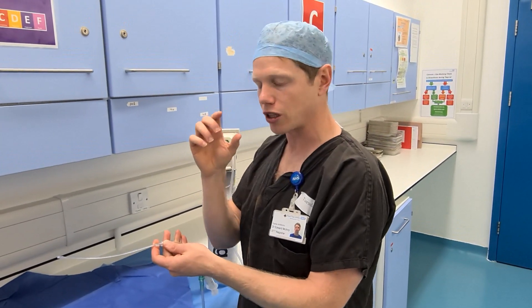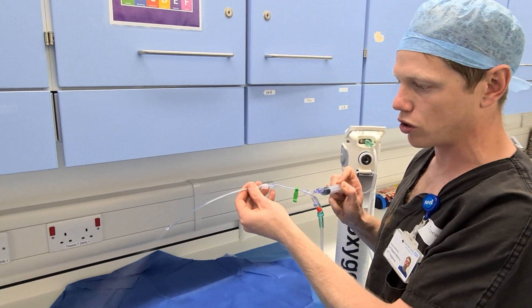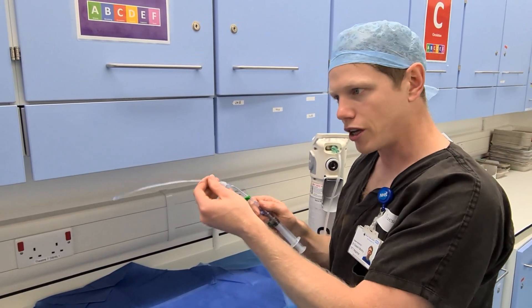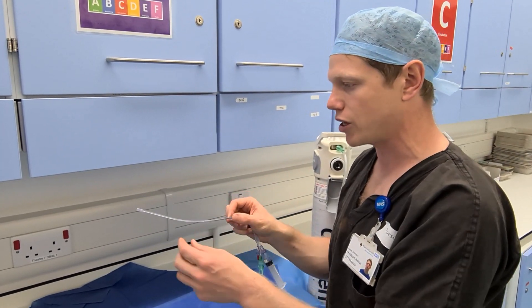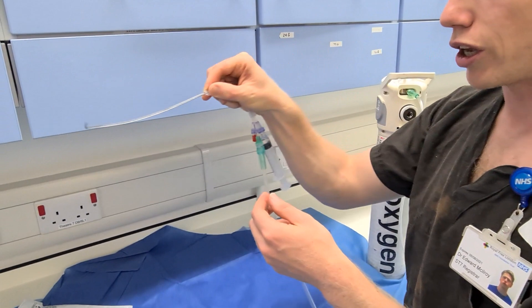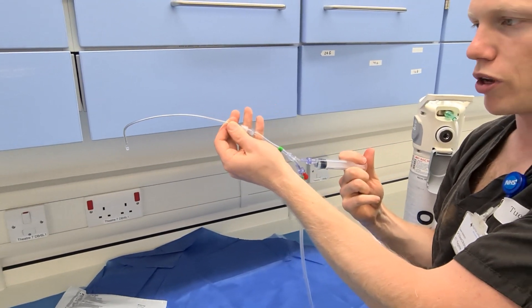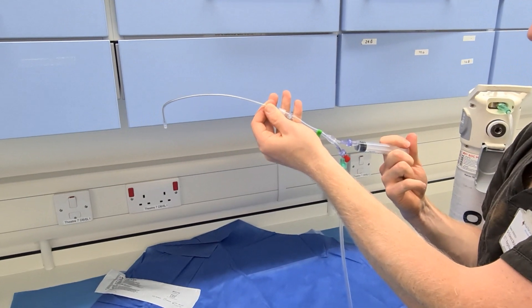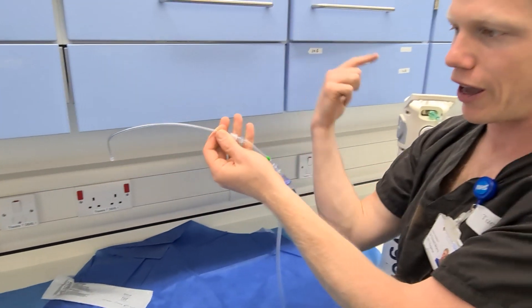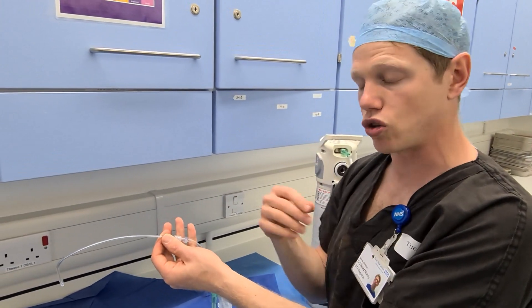In patients whose airways don't open particularly wide, ideally you want the device pushed into the back of the throat and ask them to breathe with you — kind of breathe and ask them to breathe. You'll be delivering two or three sprays to hopefully abolish their gag reflex. Wait probably a minute or so, then test the gag reflex. You angle the tip of the MAGIC device using the internal stylet to maintain rigidity, bring it down to the base of the tongue or back of the throat, and ask the patient to time their breathing with you. As they breathe in, you deliver an atomised spray of lignocaine for about four or five breaths. If you're doing it really well, you should see the patient breathing the mist of local anaesthetic back out towards you, showing good excursion of the lignocaine right down to the trachea and ideally down to the carina.